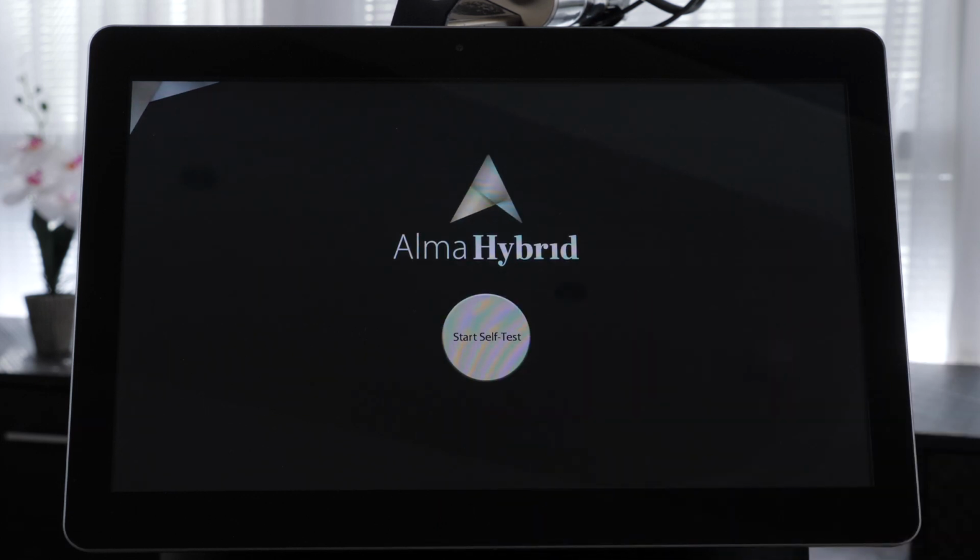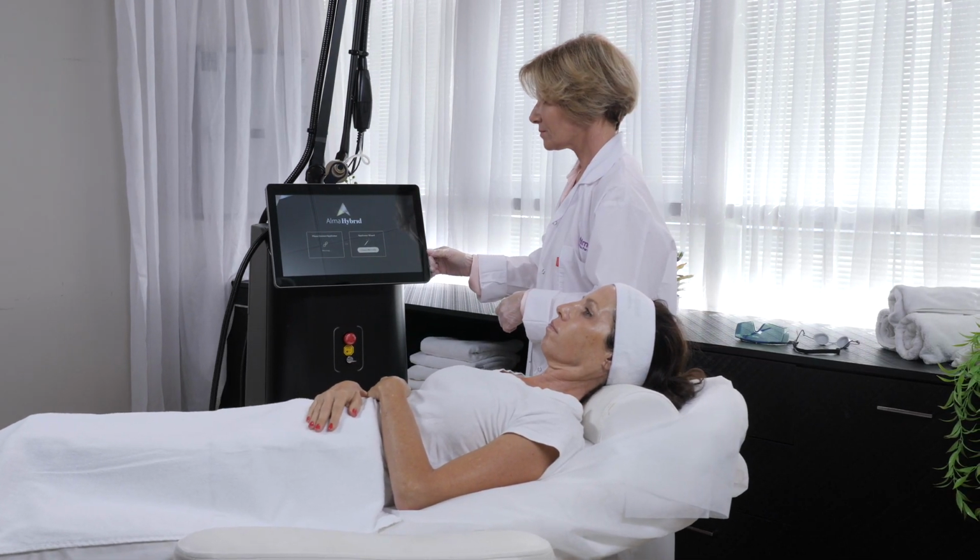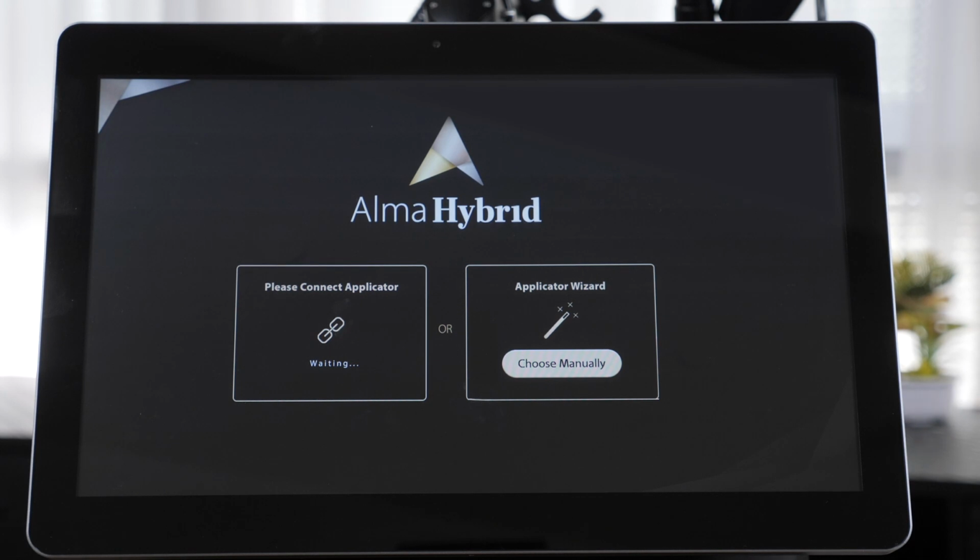The platform performs a quick self-test. Upon completion of the self-test, the main menu will appear. You can either choose to browse through the wizard or connect an applicator.